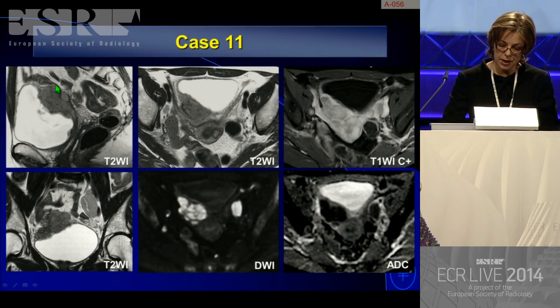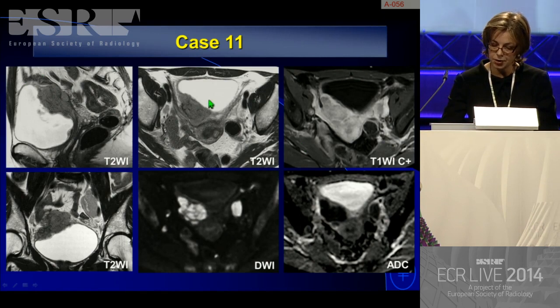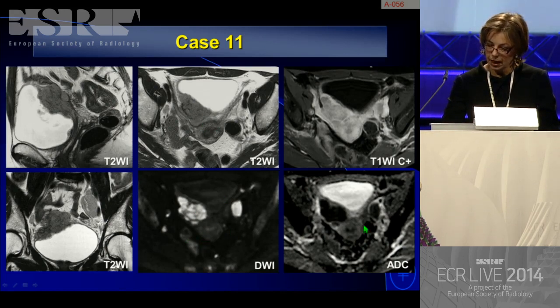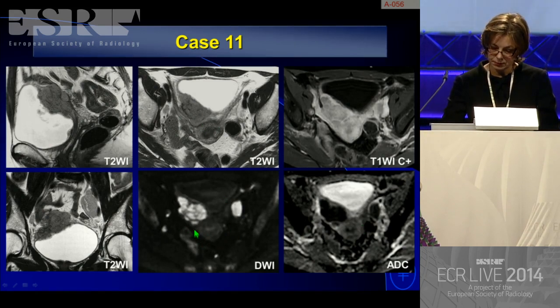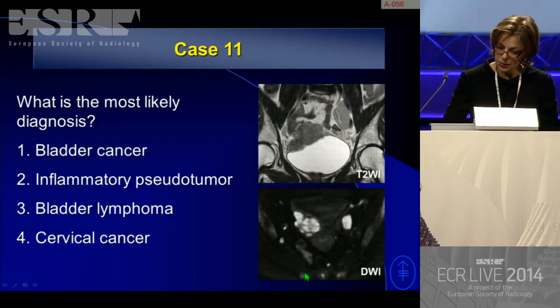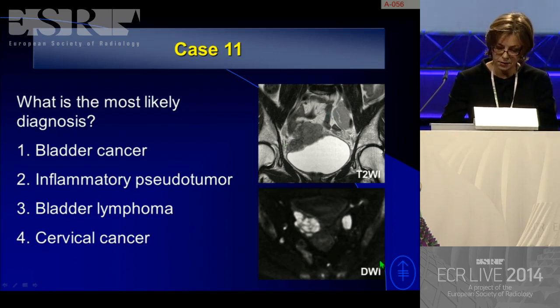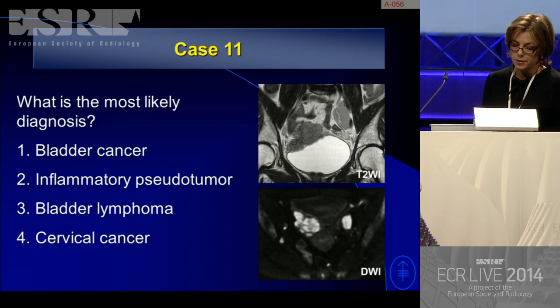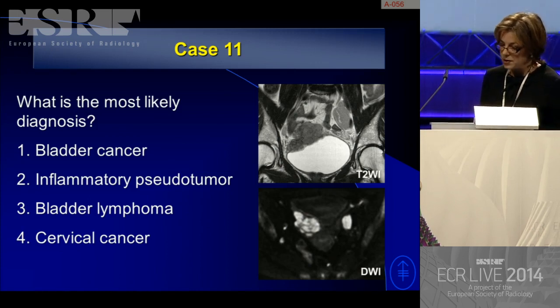On imaging: sagittal T2, coronal, and axial sequences show the bladder lesion. Diffusion-weighted images and post-contrast sequences are reviewed along with ADC maps. The choices are: bladder cancer, inflammatory pseudotumor, bladder lymphoma, or cervical cancer. The cervix looked relatively normal on the sagittal. Enhancement was very intense and homogeneous, with very restricted diffusion. Lymphadenopathy is also visible.